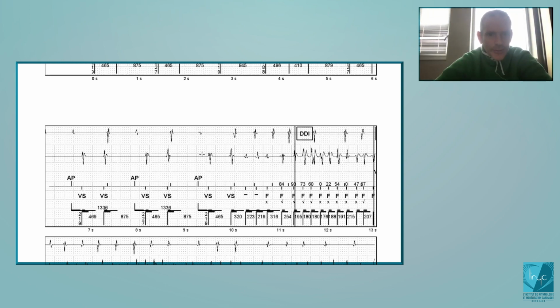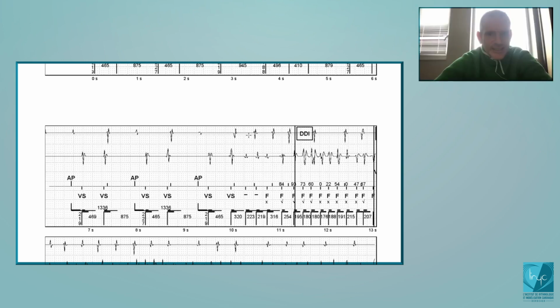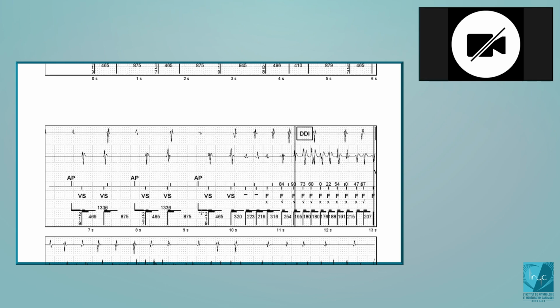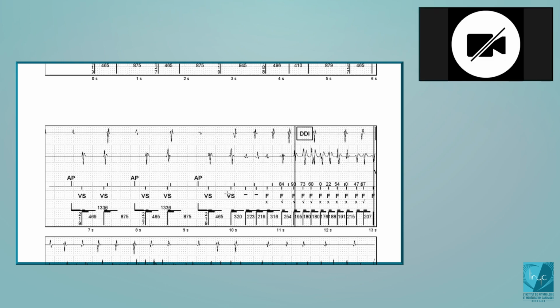So it's a dual chamber ICD. Two channels. This is the atrial channel. This is the ventricular bipolar channel, the markers. What do you see here? We can see here A paced and ventricular sensed. Yes, but you see the numbers, and what is this here? We can see the relative and absolute refractory periods for both atria and ventricles.